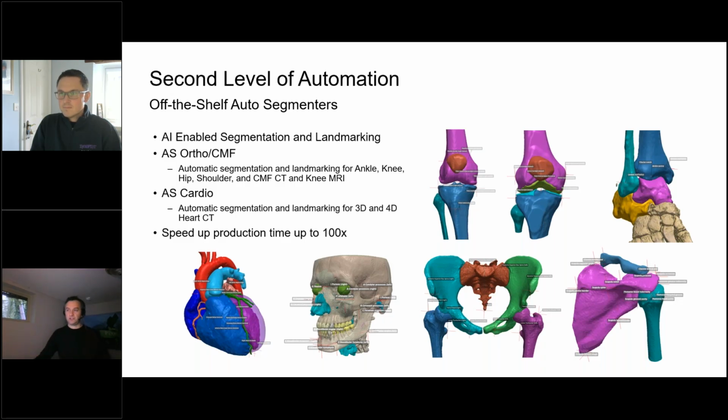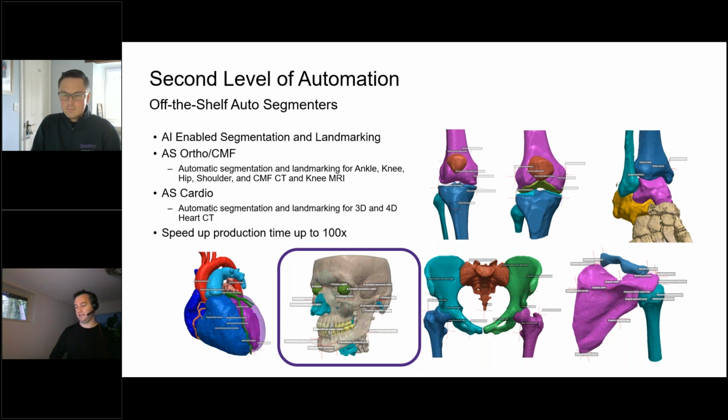So these are the off-the-shelf tools, and these are just added on to our base software. So these can be licensed tomorrow and just applied right away. And today, Ross will be giving a bit of a demo, a focus on the CMF applications. This is our latest one that we released, and how that works.